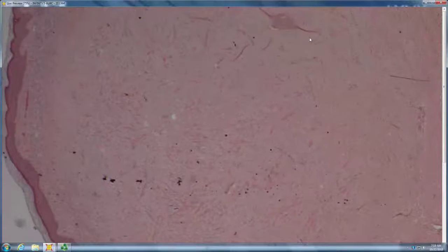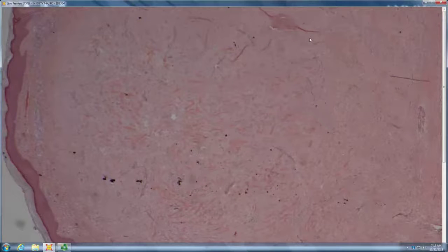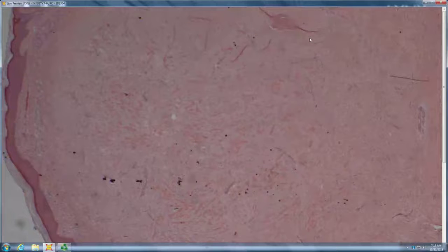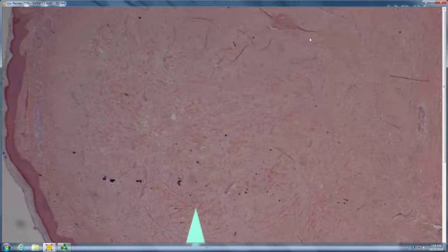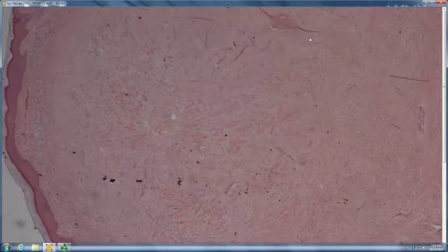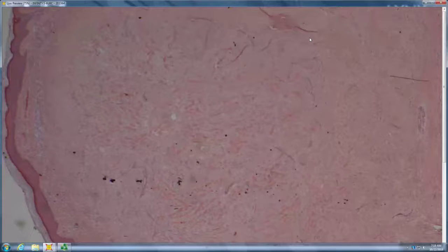Tell me about this big fibrotic nodule. So it looks like there is some bubblegum collagen in there as well. There is keloid collagen in the center. So what kind of a lesion contains keloid collagen? A keloid. A keloid, shockingly enough. Right. So you have bubblegummy collagen in a background that is otherwise whorls of myofibroblastic cells similar to a hypertrophic scar.